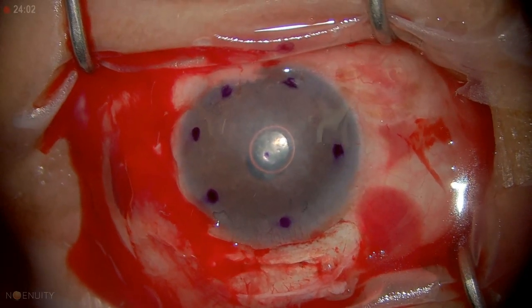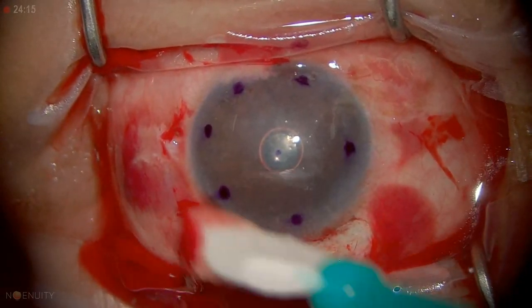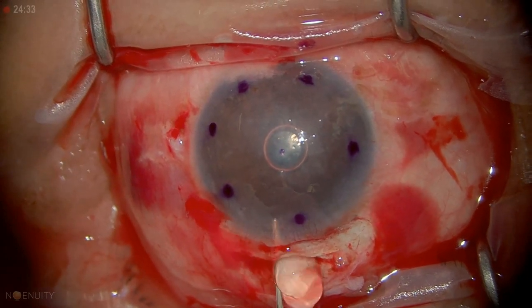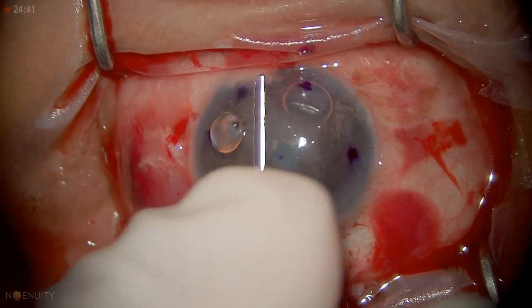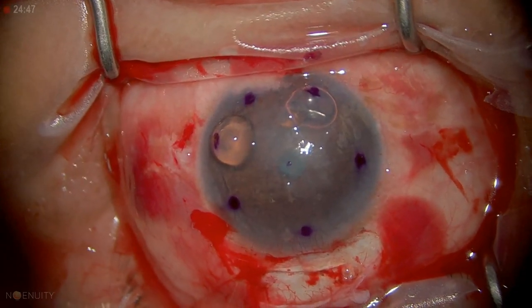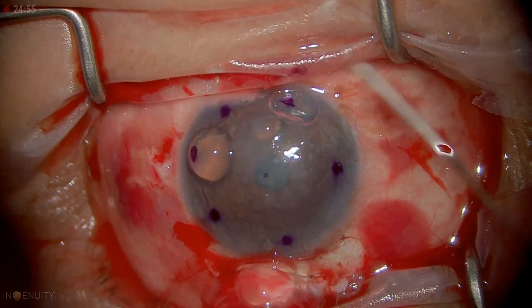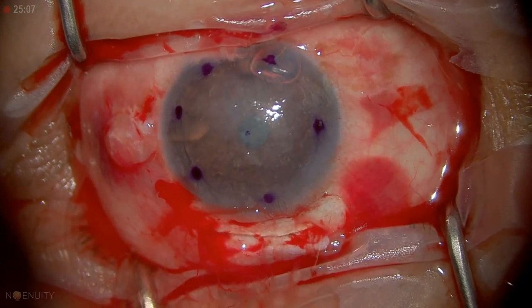Now we have a lamellar dissection of the cornea and there's a bubble in the AC and the chamber is flat. Her orbit is kind of small, palpebral fissure is small, so there's some posterior pressure — that's why that bubble came out so fast. So what we're going to do is inject some Healon into that potential space we just created. You see that bubble move? That tells me the Healon has filled all this space, and we're able to push the bubble all the way to the edge of the dissection.